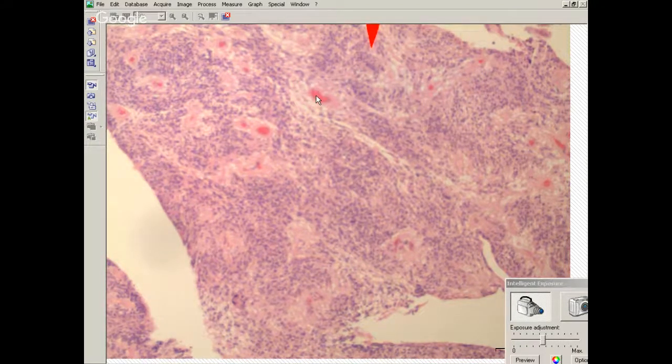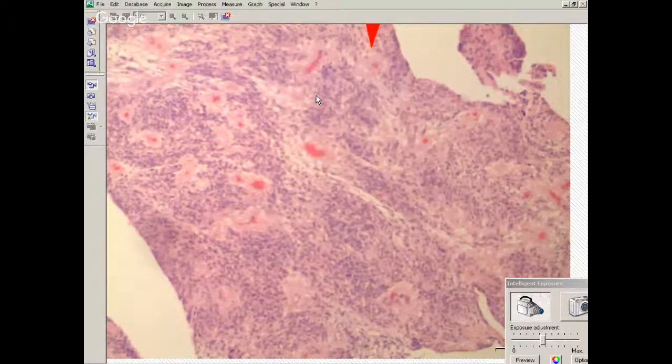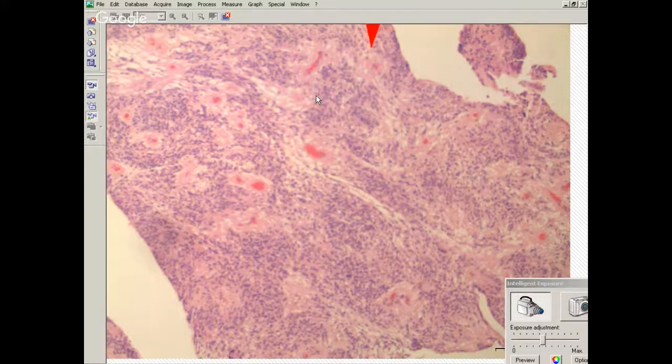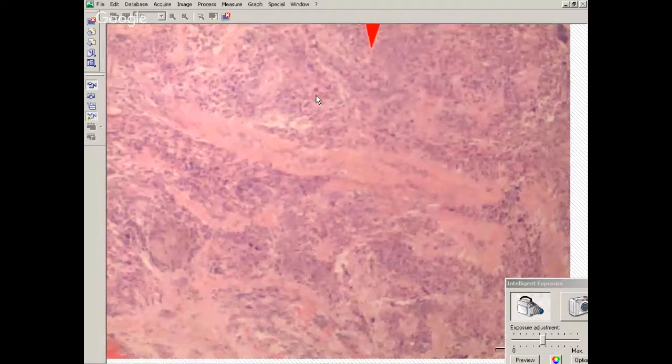So you want an ependymoma, it's typically by the ventricles, it's typically an expansile mass rather than an infiltrative lesion. Sometimes you can have ependymomas that are supratentorial, that are out at the periphery as well. But again, they're usually well-demarcated expansile masses.